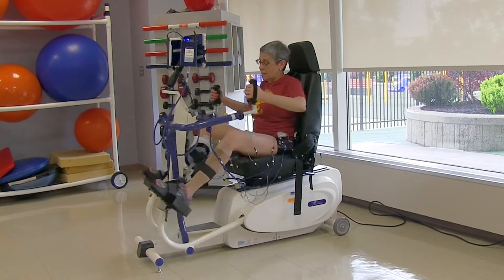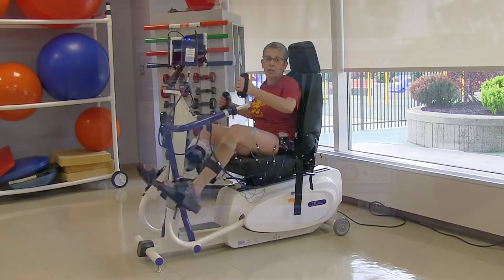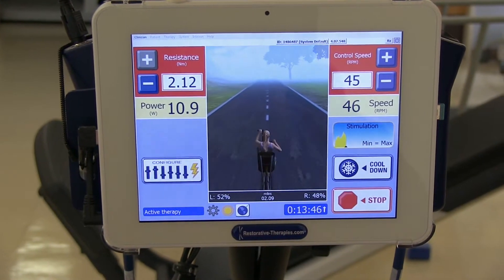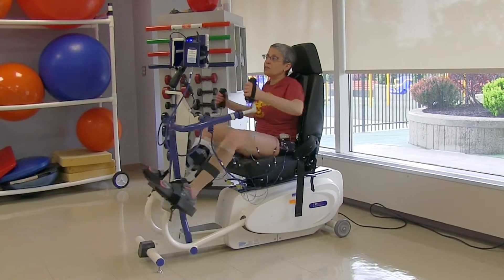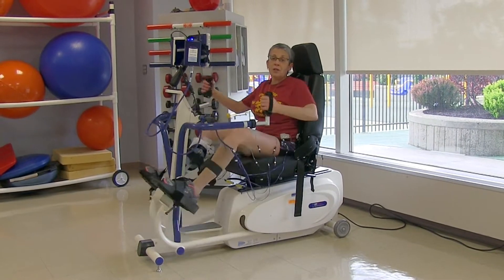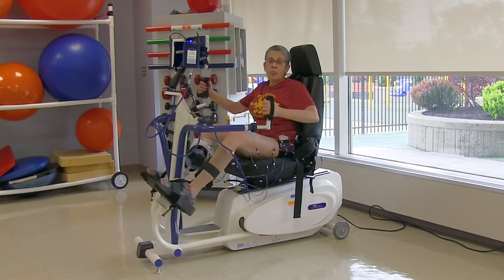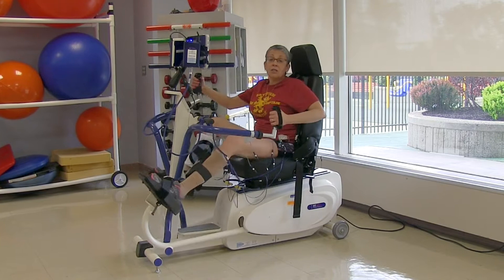It is absolutely terrific. It gives me a lot of information on the screen. It helps me make sure that I am keeping equal pressure with both legs, and it tells me what speed I'm going, how much stimulation I'm getting — it's really, really helpful. I have been using the machine for quite a while now and it's comfortable and I really enjoy it.